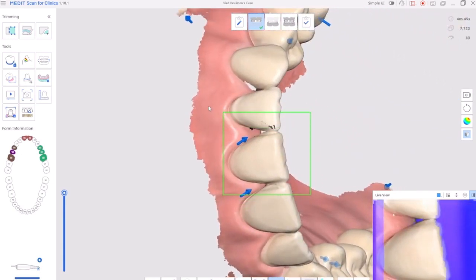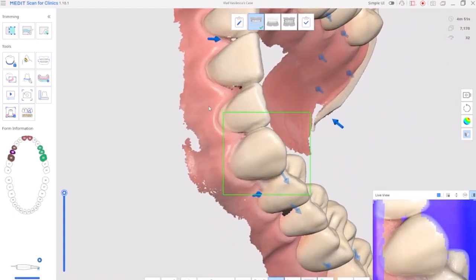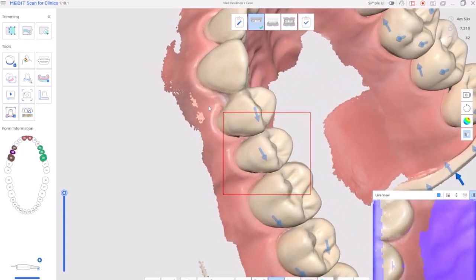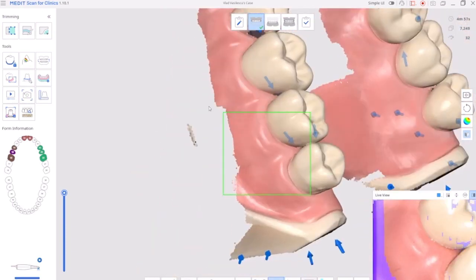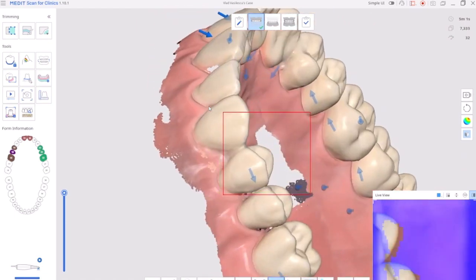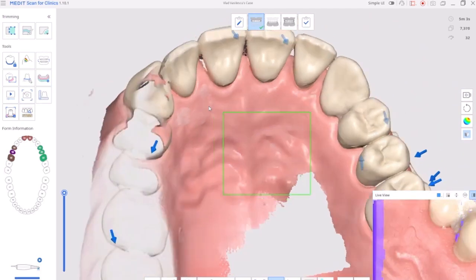The zones that are more difficult to scan are around the molars and interdental zones, and it is obvious that the smaller the intraoral piece of the scanner, the better the scanning will theoretically be, because you can get into zones where, if your scanner is big, you simply can't get.